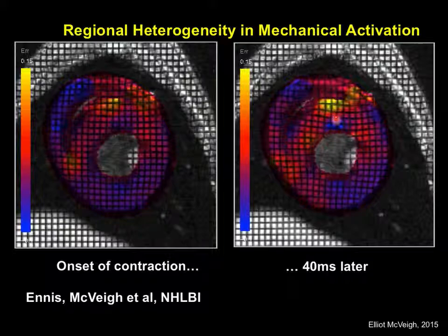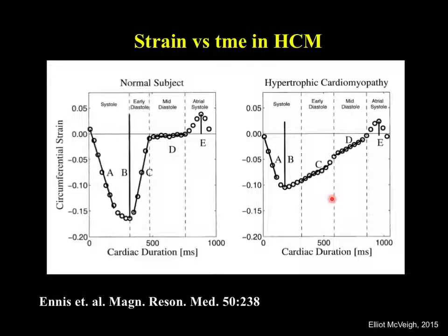So you're seeing transmural activation of muscle in the myocardium, right? You get a lengthening here as it contracts, shortens in this direction, and then it compresses here. So you get these extraordinarily detailed mechanical strain maps of the myocardium. These can be used to differentiate between, say, patients who have normal mechanical contraction and those who are headed down the heart failure route, and so their muscle is contracting abnormally.